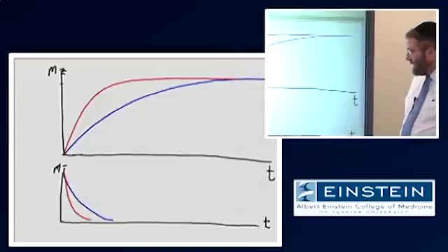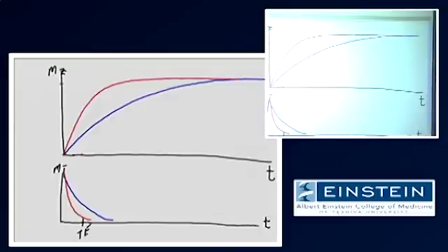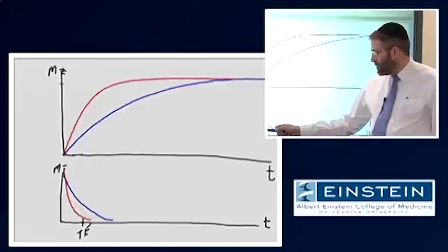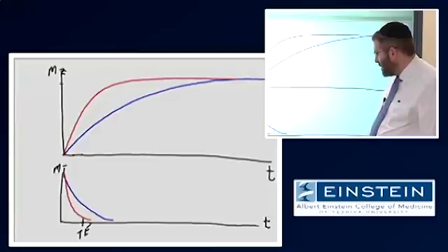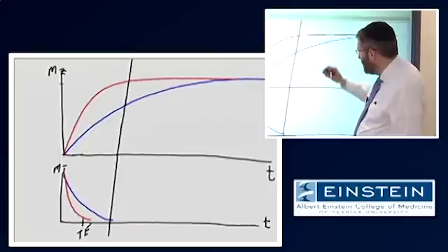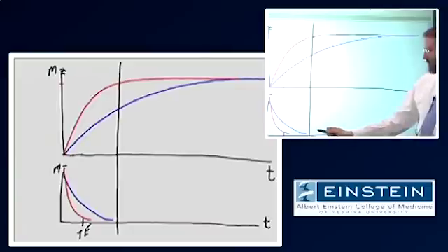Okay? And we could choose to sample at some TE. And at that TE, we will generate some contrast, a different amount of signal from these 2 tissues. That is a function of the fact that they have different T2. Well, that's fine. Now let's change this. And at this point in time, we're going to start the process all over again.